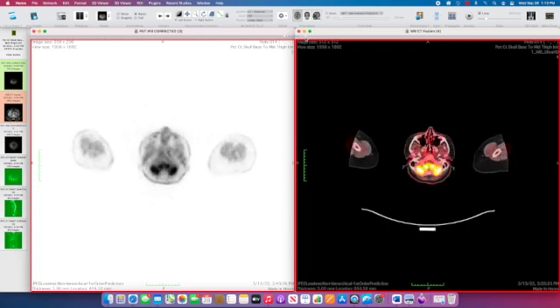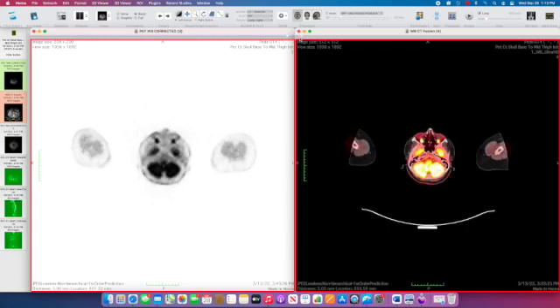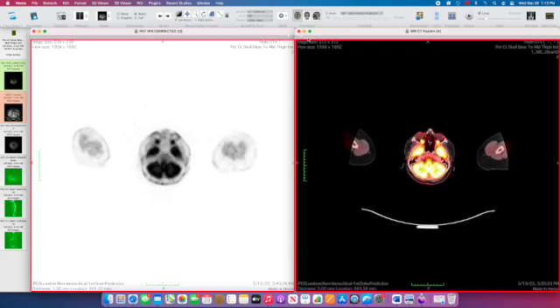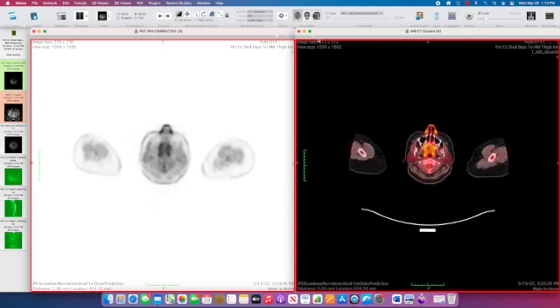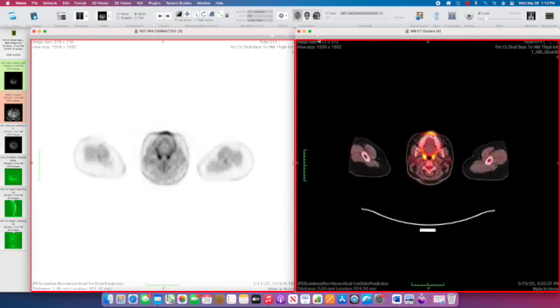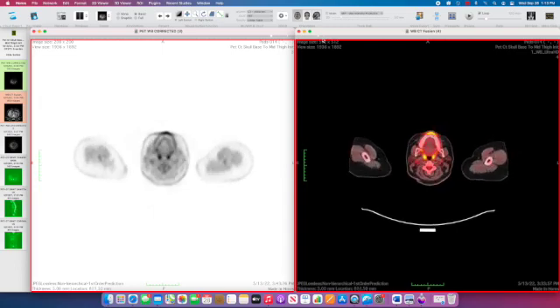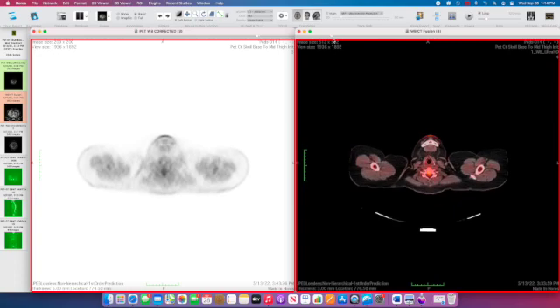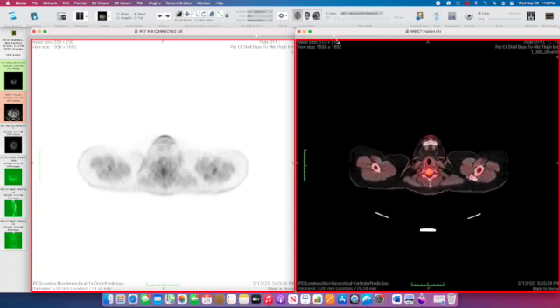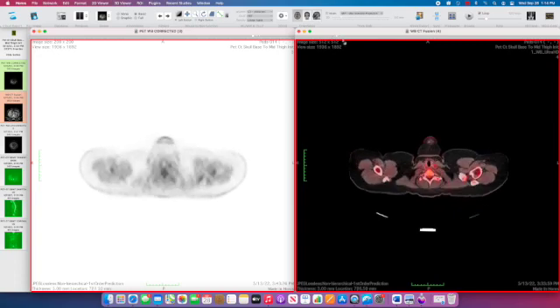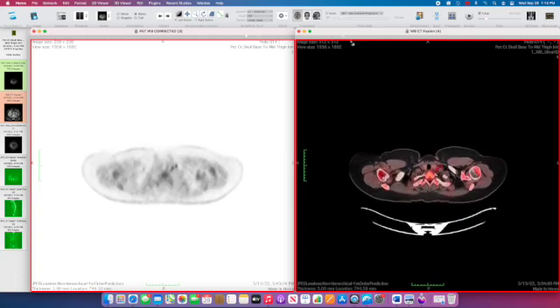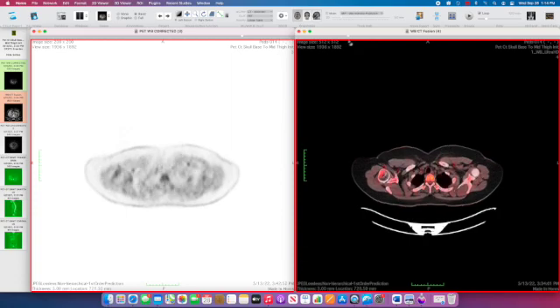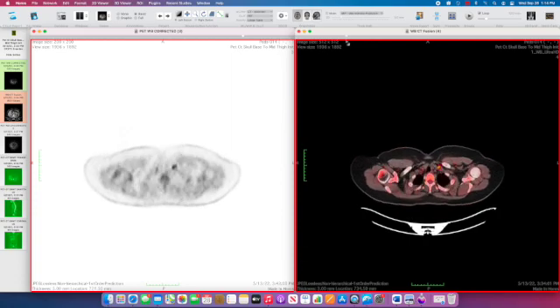We have physiologic uptake in the brain, which is an obligate glucose user, some physiologic uptake in the tonsils and nasal pharynx—these things all normally use some glucose. We do start to see some abnormal lymph nodes in the lower neck.